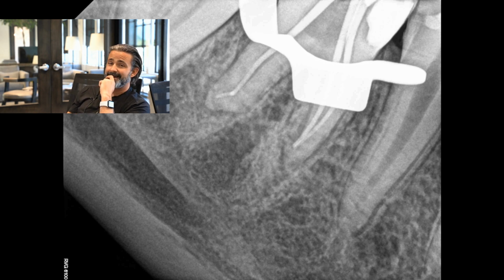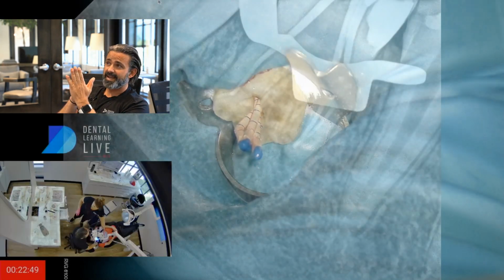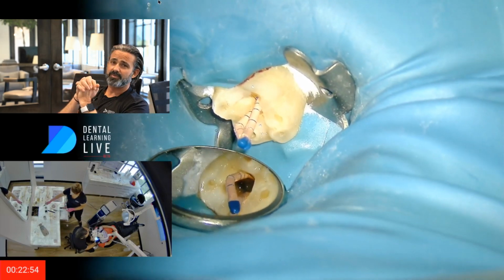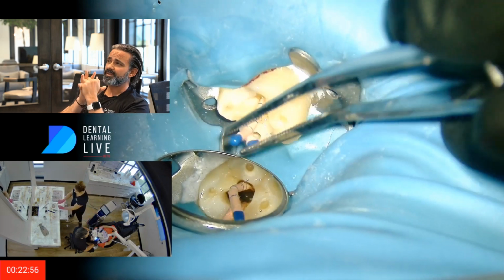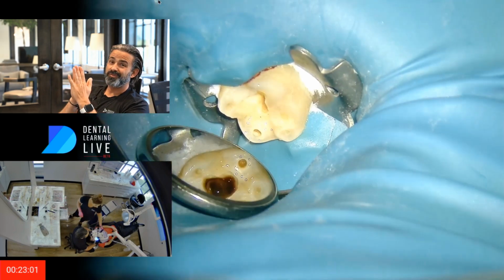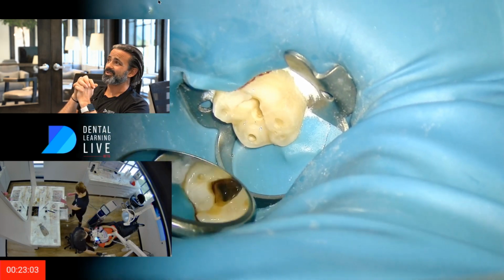But back to that wall, we're going to get up to it here. Pay attention, you'll see a trough tunnel right underneath that composite. If that wasn't a very well set composite, it actually would have just dislodged the composite. But because the composite was built on active dentin, it stayed intact because it had a true bonded surface that composite was built on. So I think that's a great technique for the dentist to do it that way. I like indirect pulp caps, and I like GentleWave removing that and leaving the composite intact as well.